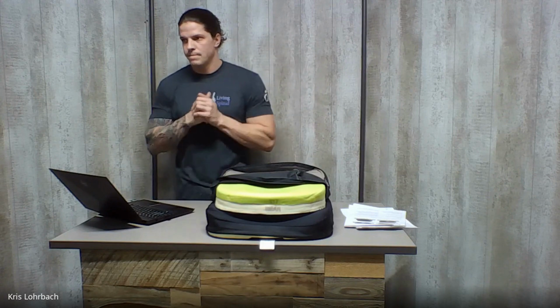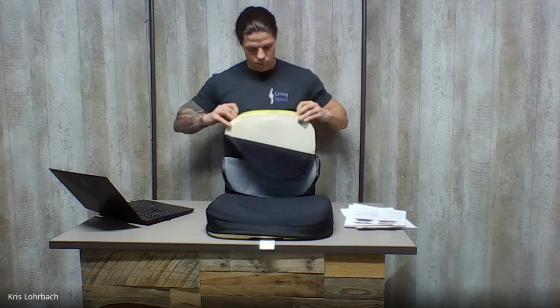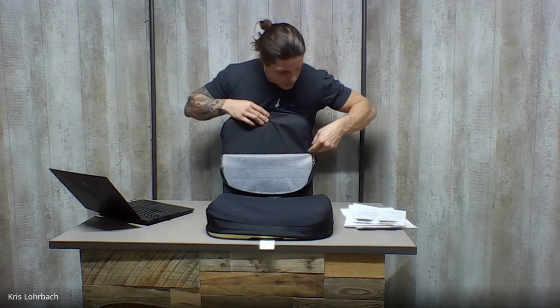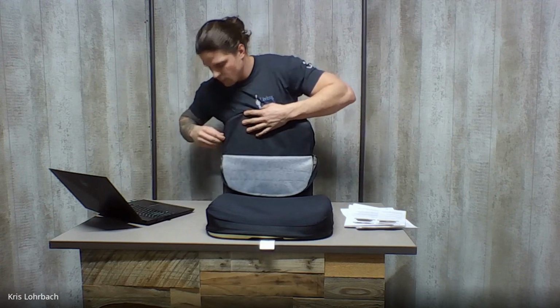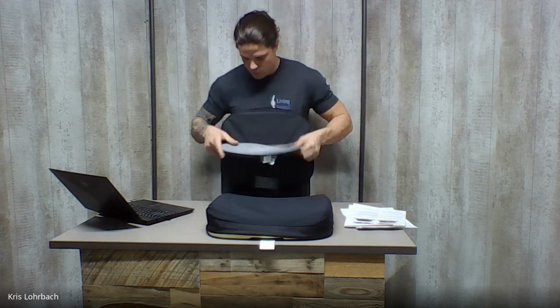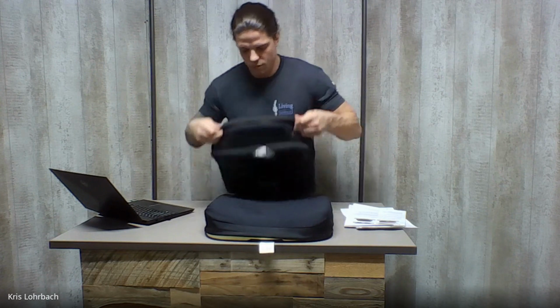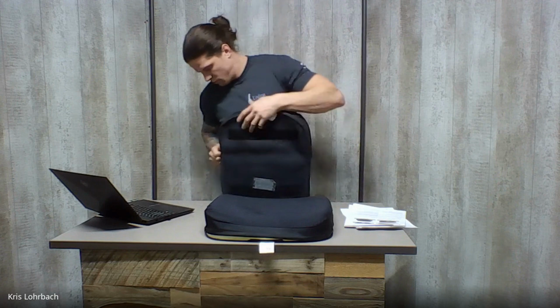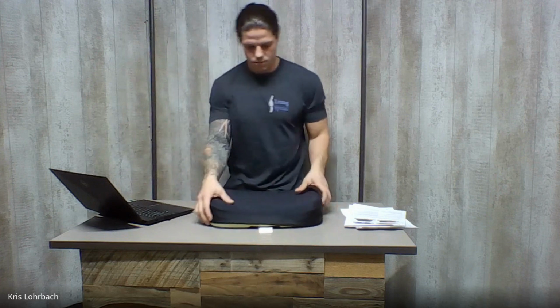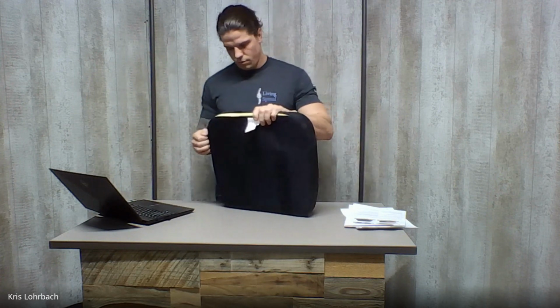I don't want to go somewhere else with this, but one thing that I forgot to mention about the air, and it's just one kind of downside with it, is it can be hard to transfer onto air. Low cushions can roll up as you get across. So what we need to think about is how good is the person's transfer? How much lift can they get? If they're light, real active, and they just pop right over and get lots of lift, they don't drag across or slowly move across.